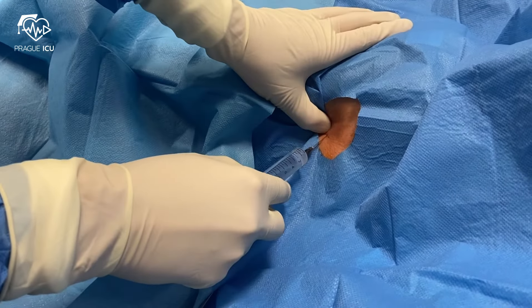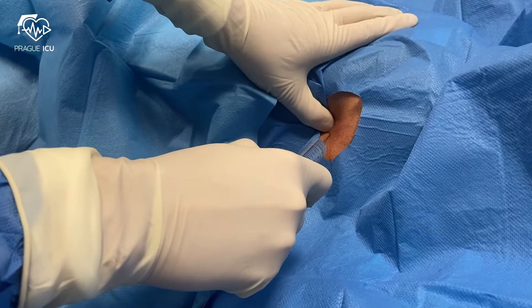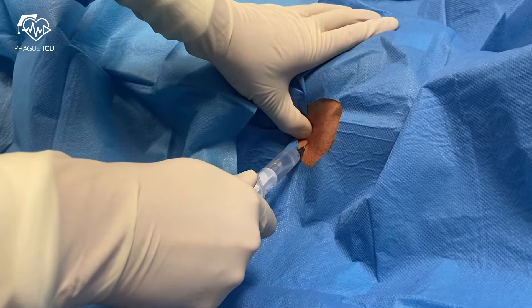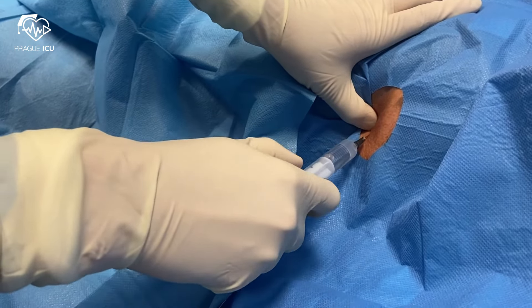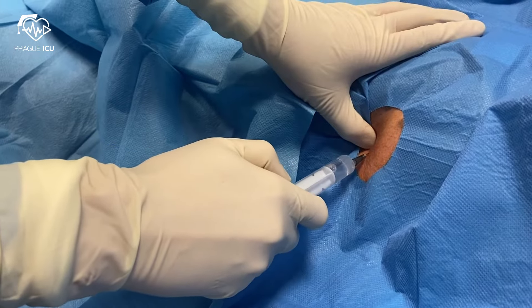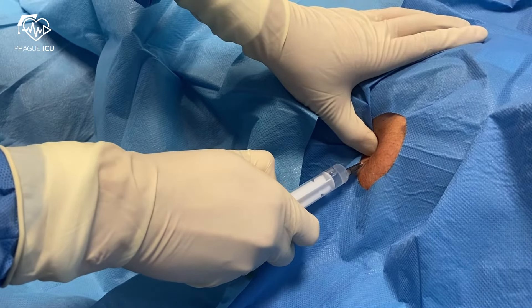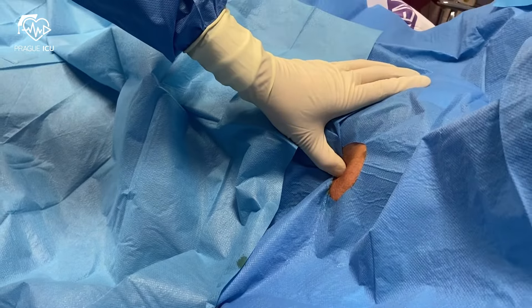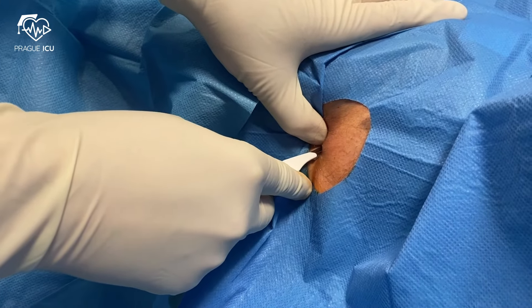We use 10ml of local anesthetic. Make an incision with the blade to create a nice wide tract that will facilitate the drain insertion.